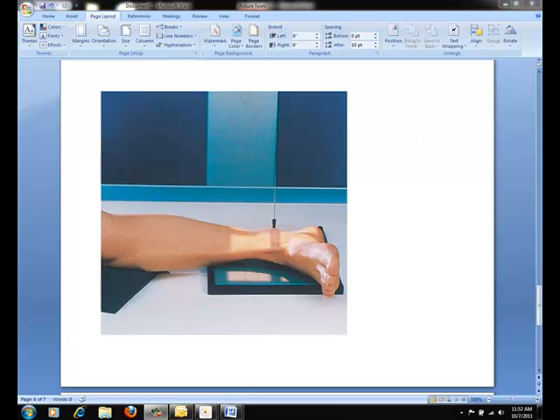You are now ready to move on to the medial lateral projection. Have the patient lay supine, turn toward the affected side until the ankle is lateral. Place the long axis of the IR parallel with the long axis of the patient's leg and center to the ankle joint. Ensure that the lateral surface of the foot is in contact with the IR. Then, dorsiflex the foot and adjust it in a true lateral position.